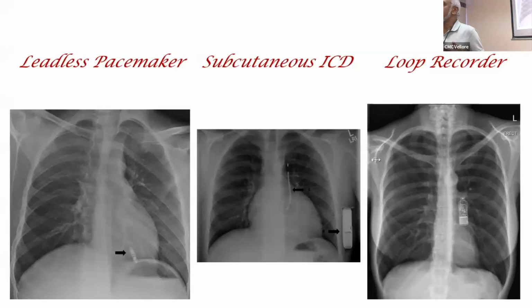Permanently. Yeah. And the leadless one? Leadless goes into the chamber, inside the heart, and gets hooked onto the myocardium, the endocardium, yeah. And after that, all the wires are removed. There's no wire, just this. It's got a small battery and it can actually pace the muscle.